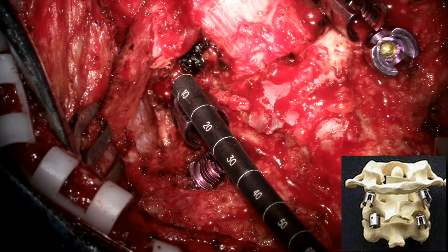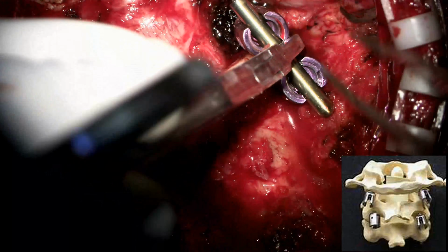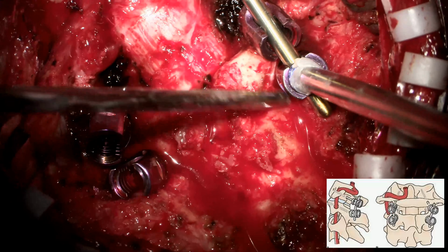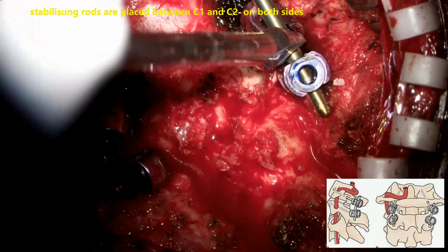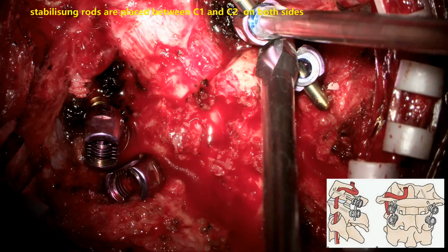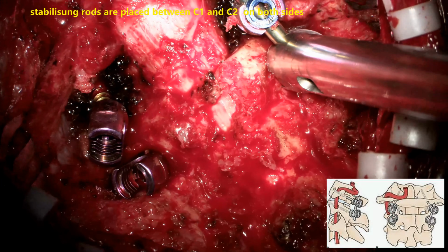Next, the connecting rods are measured with the malleable measuring rod, and the rod is prepared. Usually we prefer 1 millimeter superiorly, 1 millimeter inferiorly in these cases, not to extend more than that. The screws are placed, both the screw heads, and the rod is stabilized as shown here. We prefer to use the same length anteriorly and posteriorly. I want you to see how loose the C2 is and moving during our insertion of the screws.